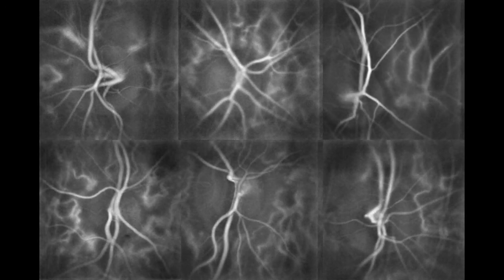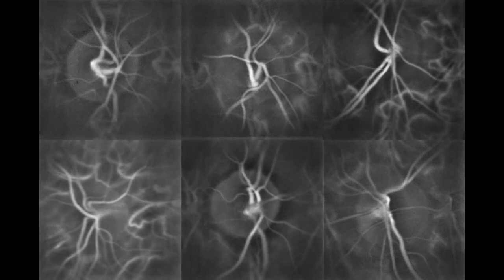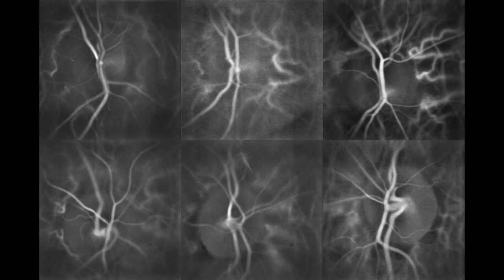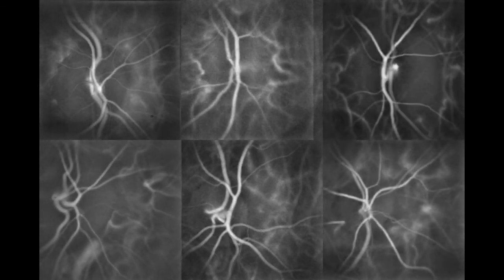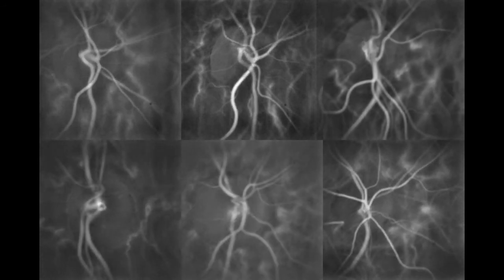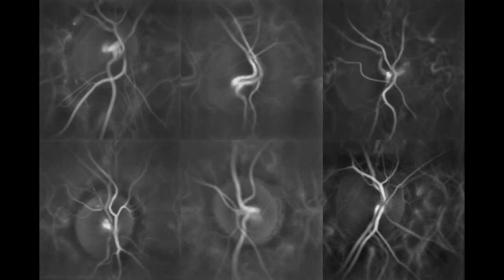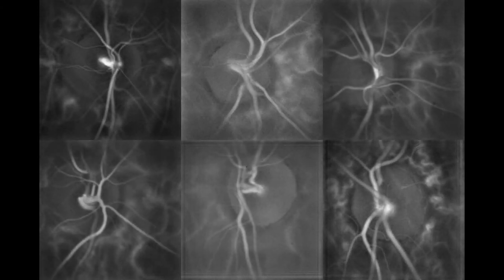So it's very nice to be able to have this blood flow contrast where you reveal the blood vessels non-invasively, but the real advantage of the method is to be able to reveal the blood flow fluctuations over cardiac cycles. All of the changes of blood flow during cardiac cycles, from systole to diastole, we can resolve them in a full field configuration. In all vessels, in arteries and veins, we can measure these fluctuations and they bring some new information by themselves. Instead of imaging the average result of this blood flow fluctuation, which is what you would get with a slow instrument of very low temporal resolution, we can find some new information related to the biomechanical properties of the arterial system from these variations.